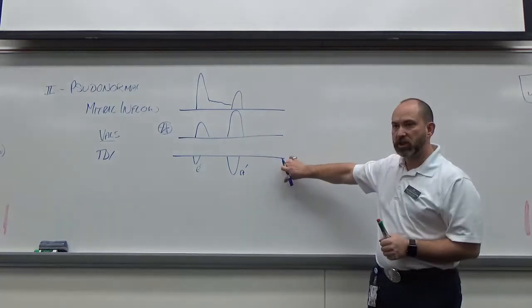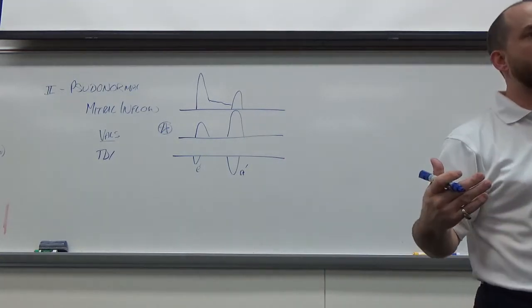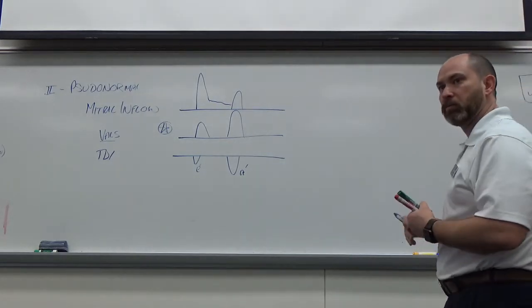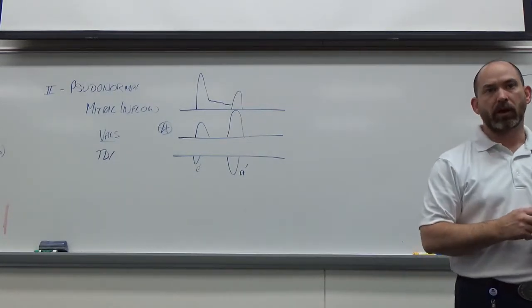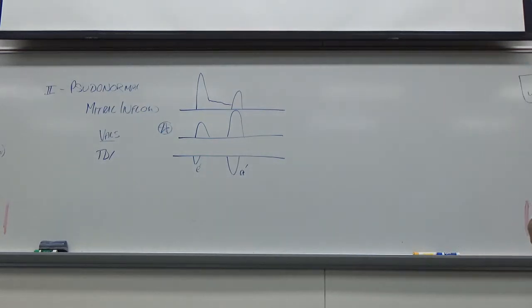Okay. So tissue Doppler is really the diagnostic tool to say this is definitely pseudonormalization. It's a pretty consistent, reliable thing without being patient dependent. Okay, so this I would really hang my hat on pretty heavily for that. So once this shows a changed relationship, it stays that way pretty much.